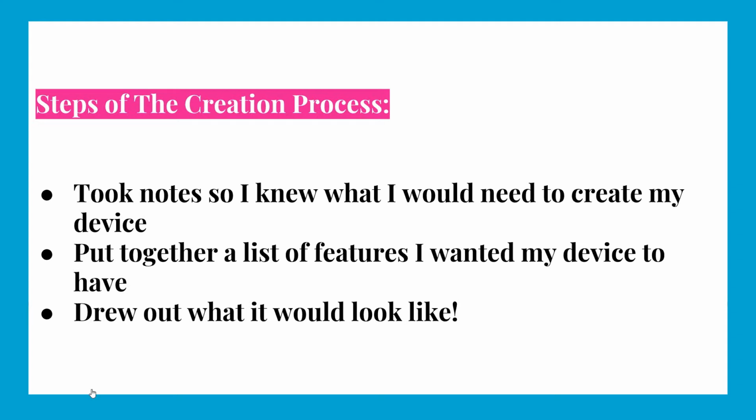So my device is going to be set up like a Dynavox. Throughout my research and throughout the class, I've learned about different augmentative technologies, and I really liked the idea of helping students communicate better and giving them the ability to actually communicate with those around them, to say their needs and wants.